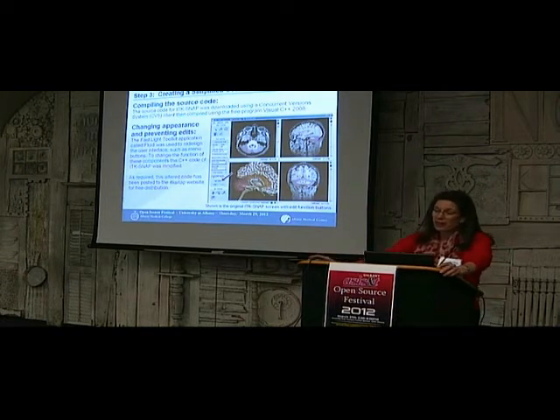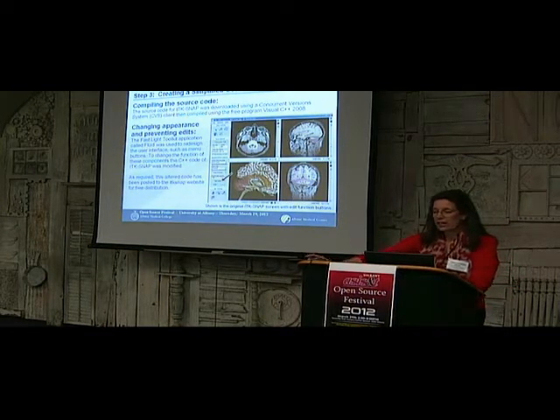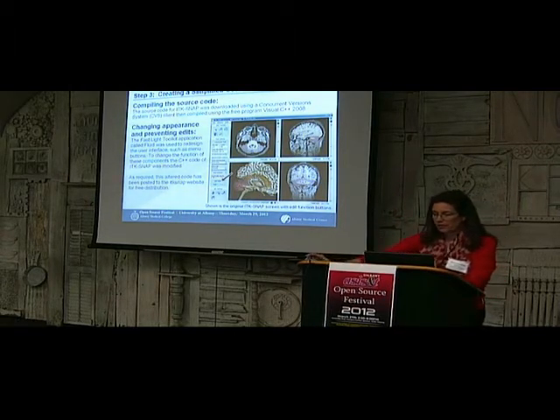And so to do that, we actually got an undergrad from RPI, Aaron Ash, and we paid him a summer undergraduate research fellowship, and he worked full-time all summer, and he compiled the source code for us, which was actually quite a bit of work, because there are lots of tools embedded in ITK Snap that had to be compiled first. But he used a concurrent version system client to compile it, and then Visual C++, and that allowed him to then change the appearance using this fast light toolkit application called Fluid, which allowed him to move the menu buttons and to redefine some of the features on this user interface.